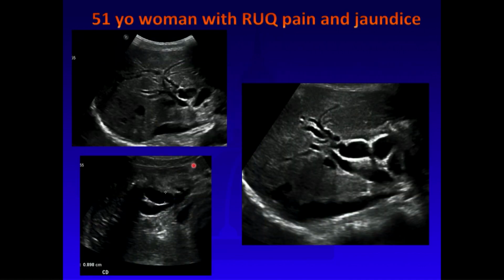And I think it's important to teach all the sonographers that if you see biliary obstruction, and this is a beautiful case of biliary obstruction, there is intrahepatic biliary tree dilatation, the common duct is markedly dilated, even the cystic duct is dilated. Don't give me just images, right? Try to find out, because we are there to problem solve. So try to find out why this patient has this much biliary tree dilatation.